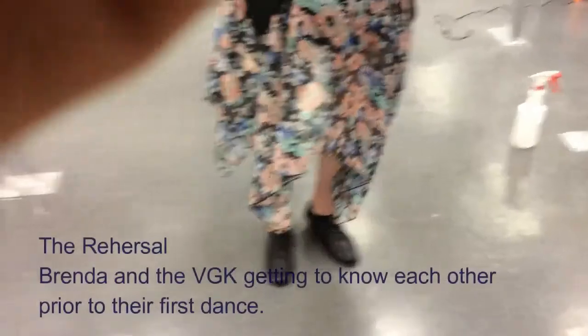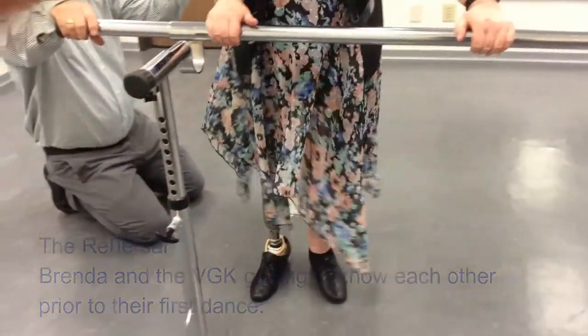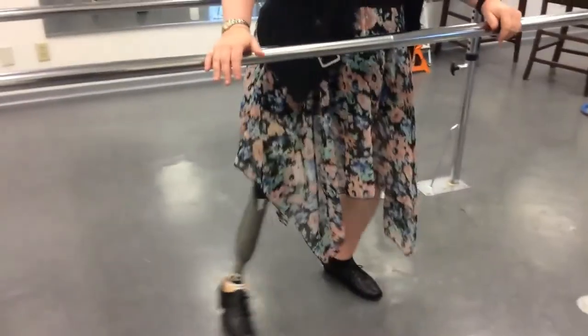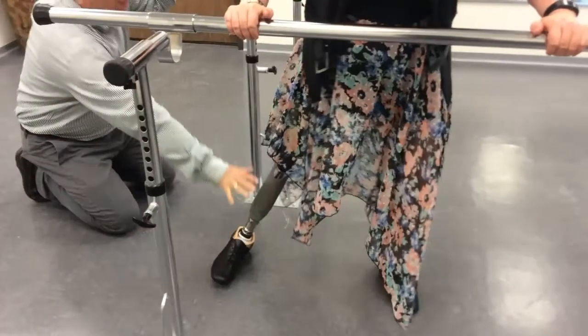So this is something different and new. This is going to take you a few sessions playing in the parallel bars in front of the mirror to figure out how that works for you. You know what I'm saying? It's a whole new range for you. A cool range, though.